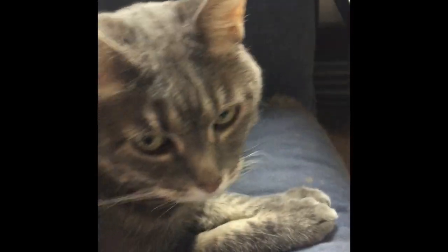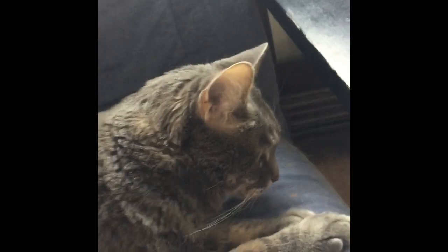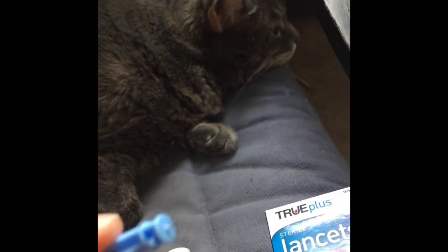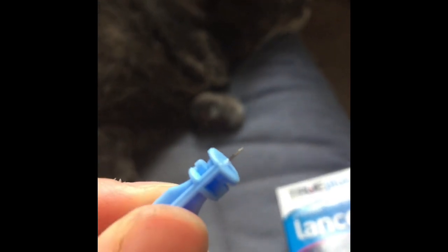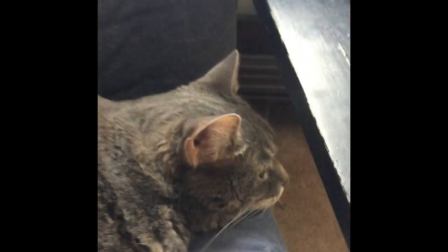So let me just pull the little lid off here — just twist this off. You can see it's just really, really small, a little needle. So now where do you want to poke the cat is actually right next to the vein.